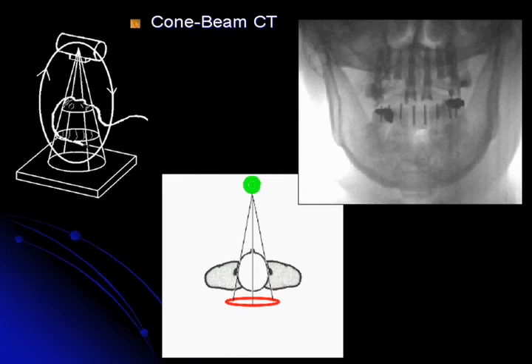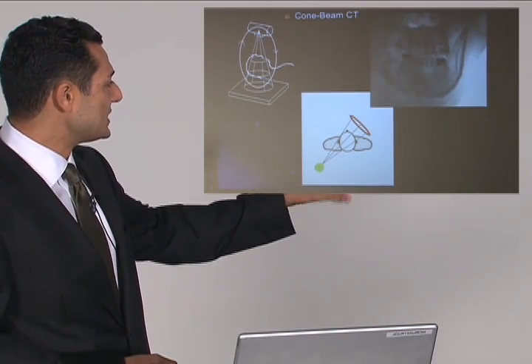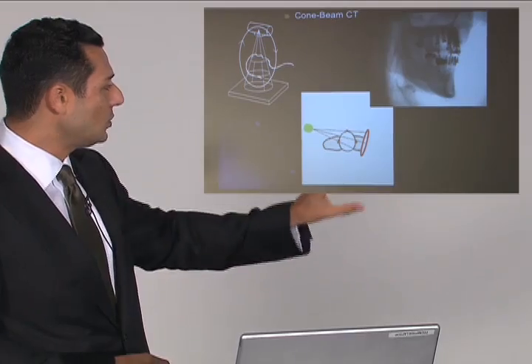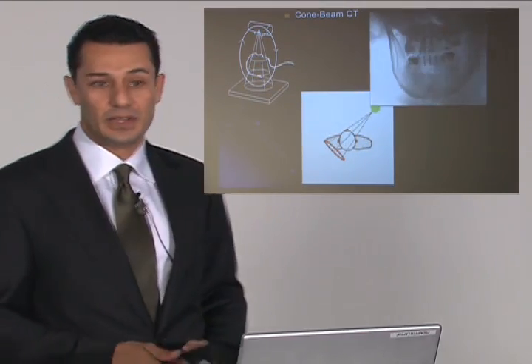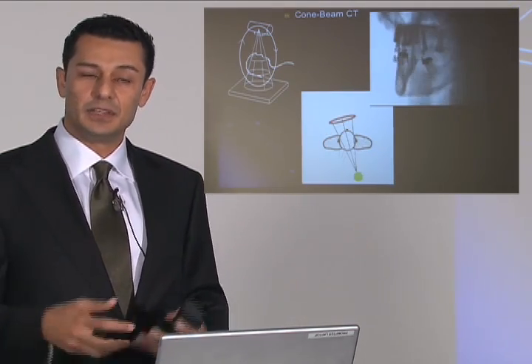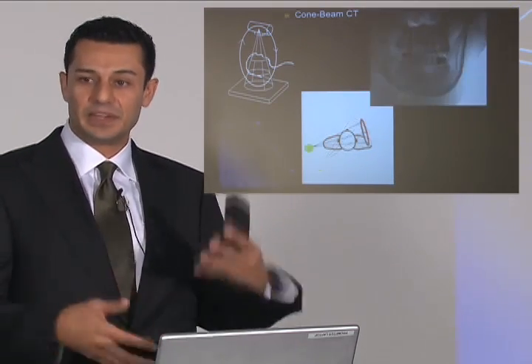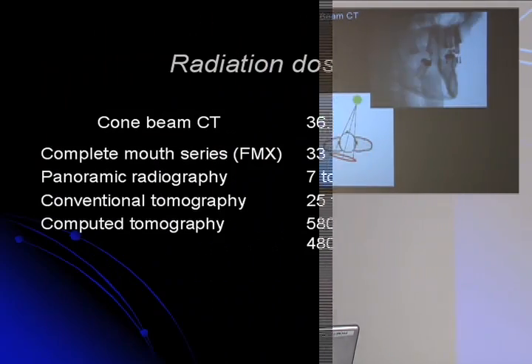Cone beam CT also gives you that X, Y, Z, that 3-dimensional reconstruction, but it does it by acquiring it through a cone. And here you can see as it scans, it's a cone-like beam of X-rays, and you acquire this 3-dimensional image. So through the software that's used for most cone beam CTs, you can do X, Y, and Z. You can do slice reconstruction. So you can look at coronal, axial, and sagittal planes.